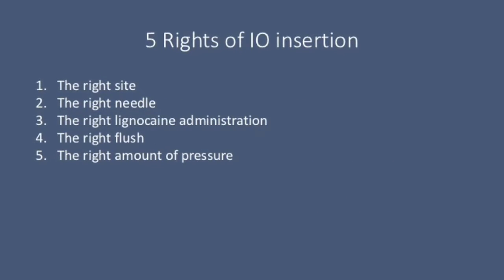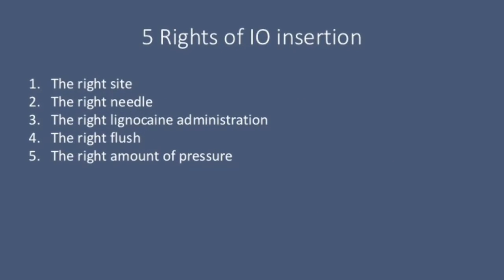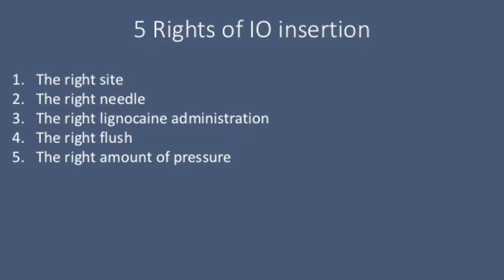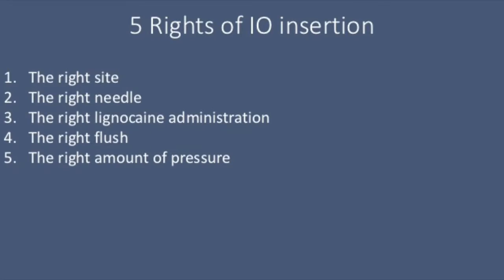Just like IV access, IO also has 5 rights: the right site, the right needle, the right lignocaine administration, the right flush, and the right amount of pressure.